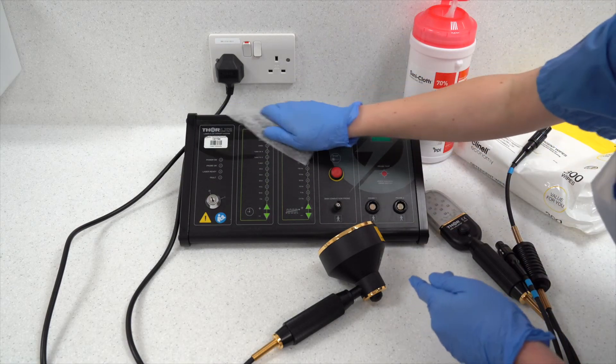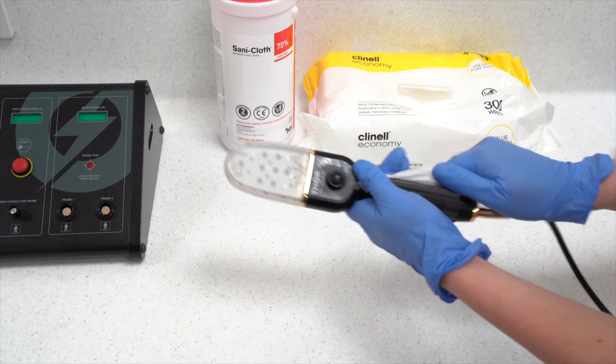Following treatment delivery, the equipment should be cleaned and disinfected following the two-stage process detailed in the standard operating procedure. The clean probes, sunglasses, key and control unit should then be returned to their relevant boxes.